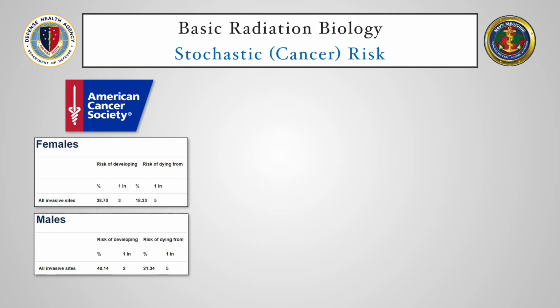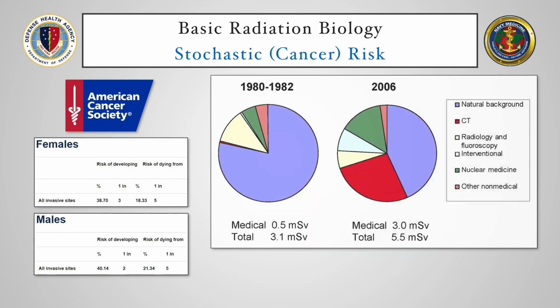From 1980 to 2006, the average exposure to medical ionizing radiation has increased from 0.5 millisieverts to 3 millisieverts per year. With the increase in patient radiation exposure, it's important to be able to relay to patients the safety of diagnostic imaging involving ionizing radiation.